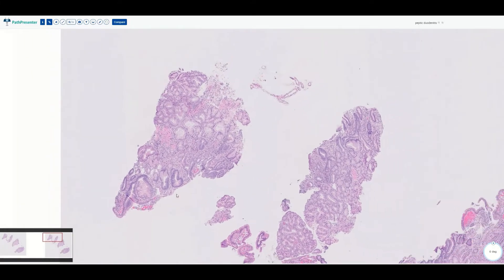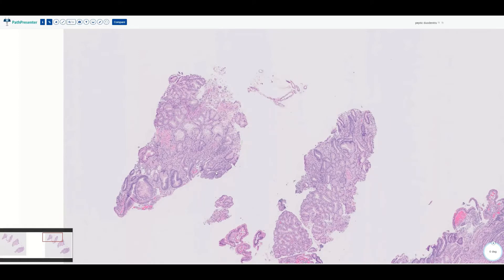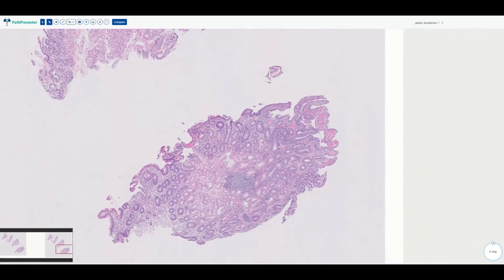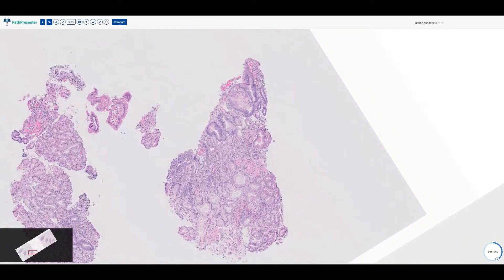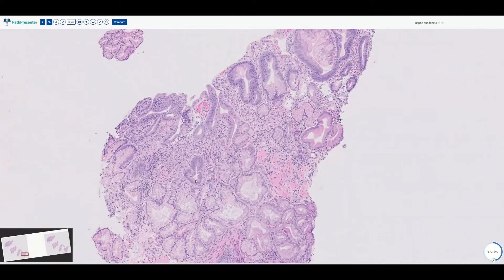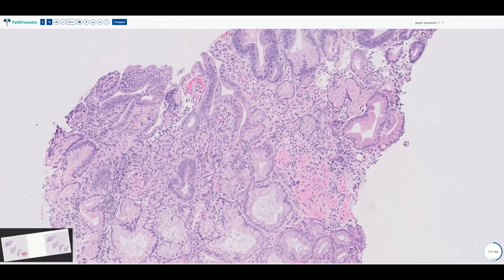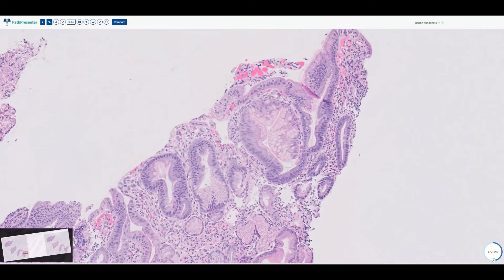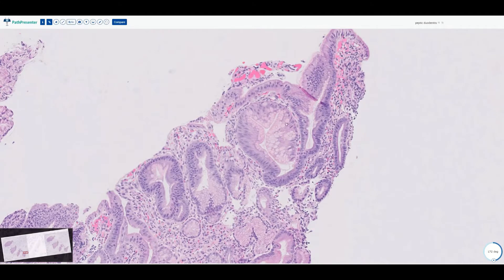Looking around, you can see that the surface mucosa is lacking goblet cells. Here is one goblet cell, but most of this mucosa is lacking goblet cells and it looks very blue, very busy. Here we have the submucosal Brunner's glands, and on the surface mucosa we see lack of goblet cells. We also see very pink apical mucin, which is characteristic of the stomach.